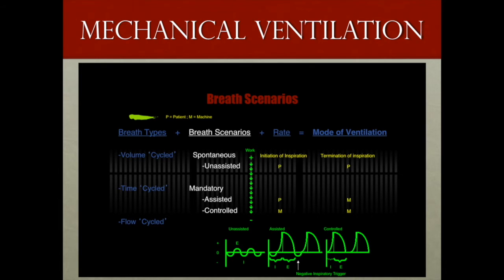Breath scenarios: there are two main categories and three types of breath scenarios. You can have spontaneous or mandatory. And spontaneous basically means that the patient is breathing unassisted. This is the mode of ventilation which requires the most work. The patient initiates inspiration and the patient terminates inspiration.